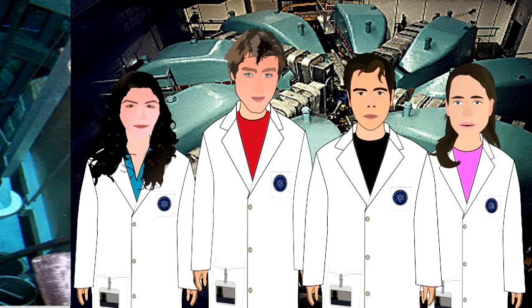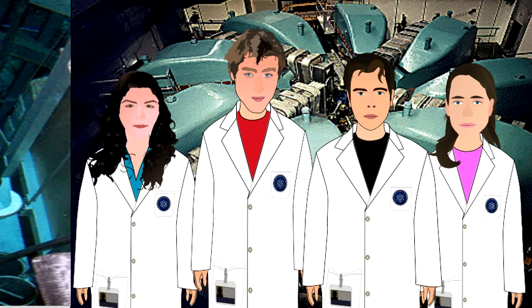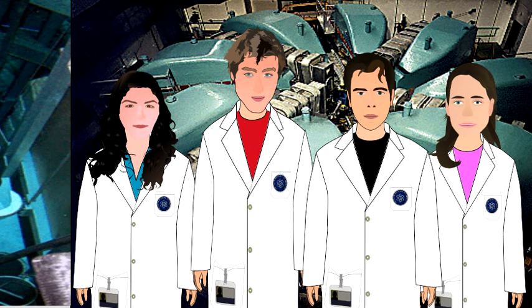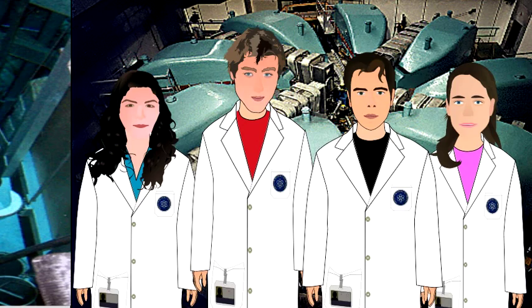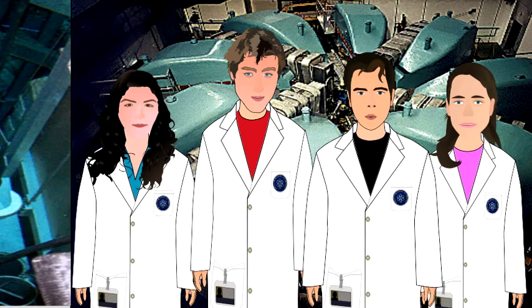This is a cyclotron. Cyclotrons are one form of radioisotope generator that provides several radiopharmaceuticals to hospitals around the world. Looks complicated. Cyclotrons are basically particle accelerators that activate stable elements by accelerating charged high-energy particles into them. There's a cyclotron beneath the VG, making many isotopes for our use. Cool.